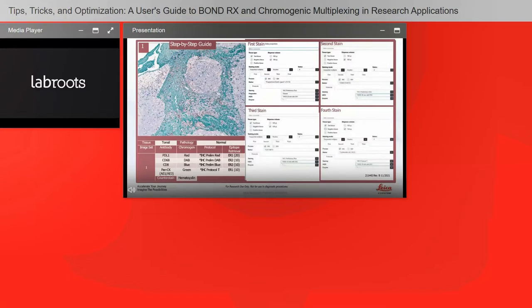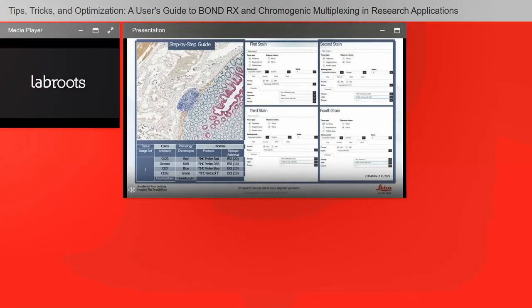As you can see in the slide setup screen, this gives you a breakdown of exactly how this image was produced on the Leica Bond RX in version 7.0 software — the first stain, second stain, third stain, and fourth stain. If you have any questions on how to set these up on your instrument, please contact your local application specialist or reach out to your sales counterpart.